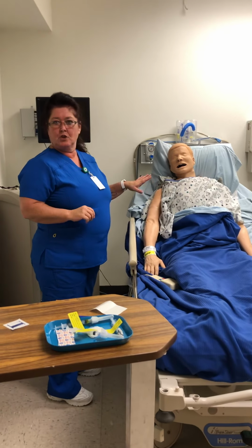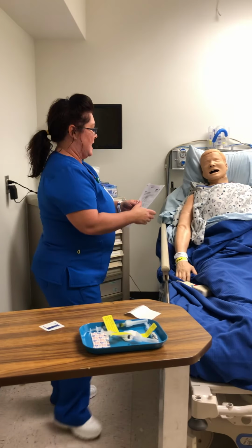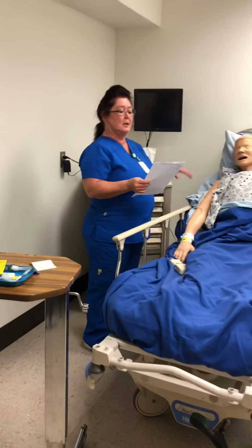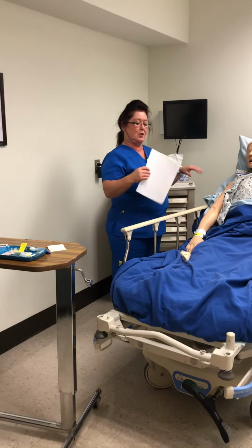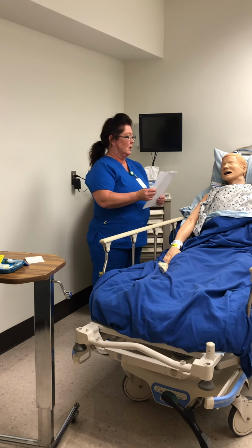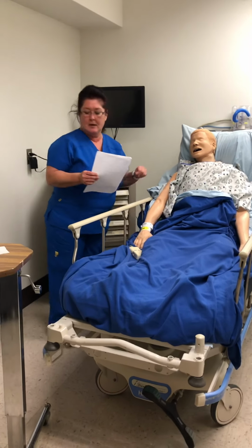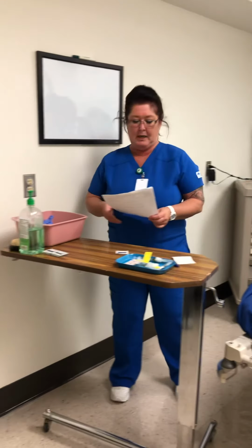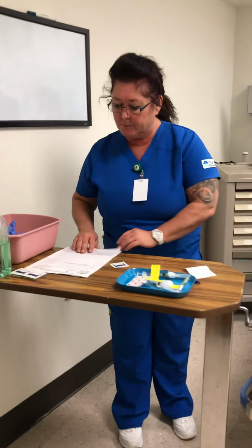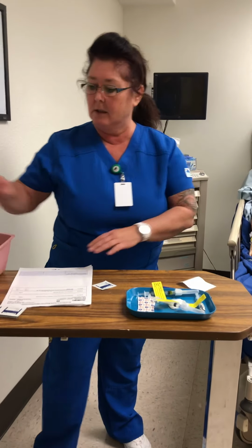I am going to check the patient's name and date of birth. And she told me that her name is Shirley Cost, which I have her name here as Shirley Cost. She was born 5/14 of 64. I have explained to Shirley that we are going to be administering her meds. Her first one is going to be the PPD. And we are going to be doing 0.1 mils intradermally.